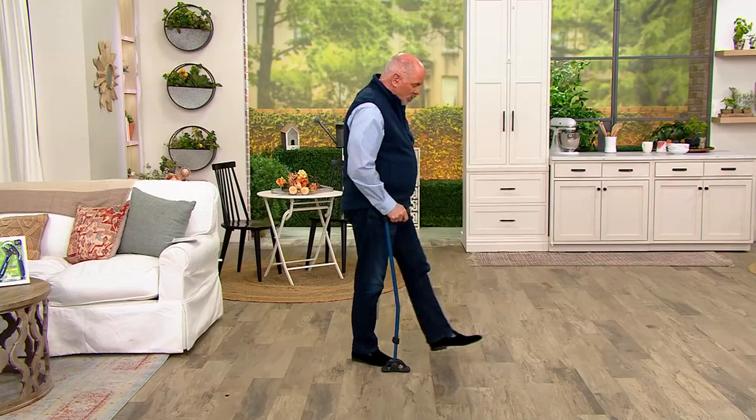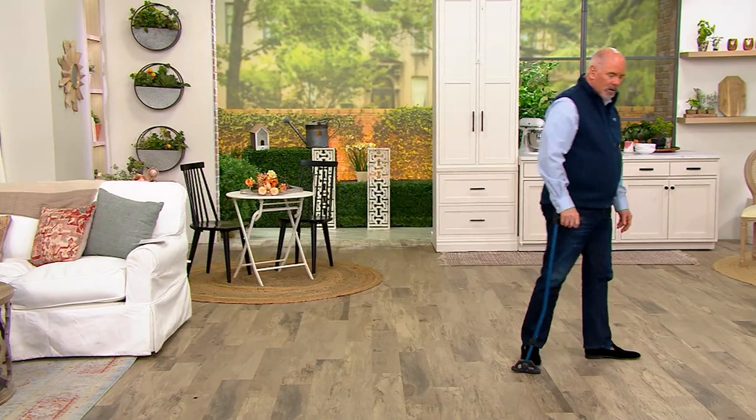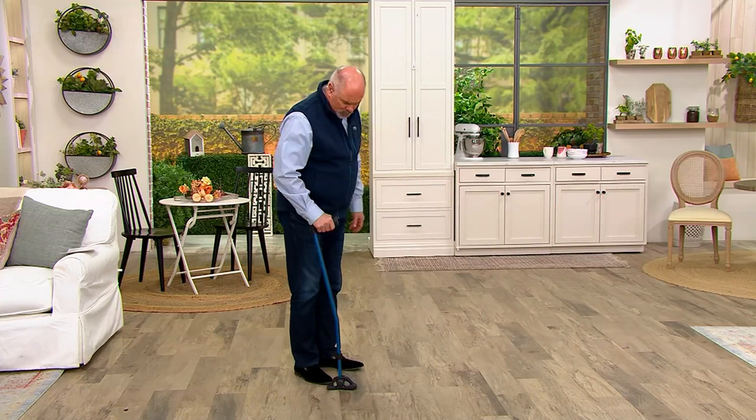This allows you to push off and gives you that extra lift, making you feel much more secure. Most people when they walk with a cane walk with the cane out in front of them — that forces the lean. This does the exact opposite. It takes a couple steps to get used to it, but then you fall into this natural rhythm with it.